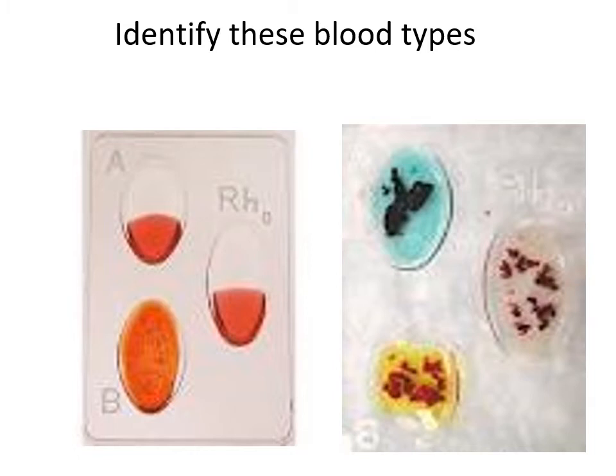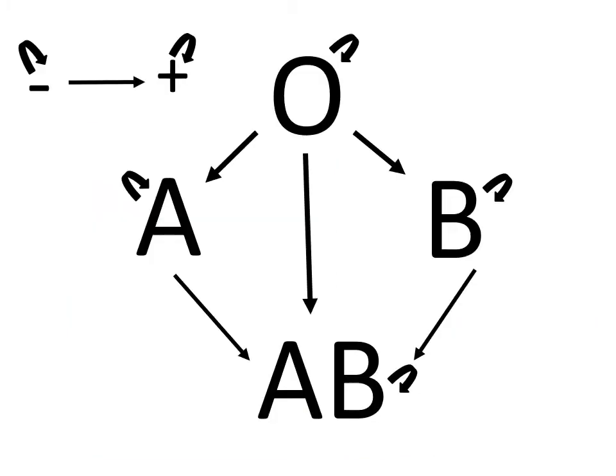Interpreting simulated blood is a little more challenging, as the simulated agglutination is more of a texture change than real clumping. That binding of antigen and antibody could occur in our bodies if we are exposed to erythrocyte antigens that are foreign. For example, someone who is blood type A contains self-antigens A. If that person is exposed to blood with a B self-antigen, they'll create antibodies against that blood. Therefore, it's imperative that compatible blood types be used in the clinical setting.